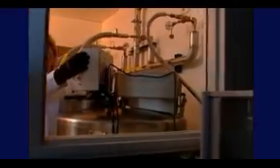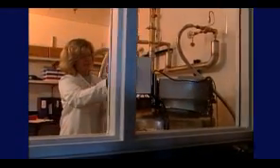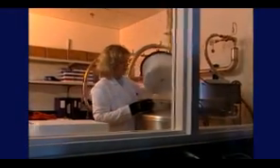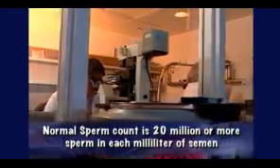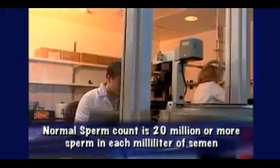The first part of a semen analysis is the sperm count, and the lab staff will do exactly that. They'll count all the sperm in one milliliter of semen. A normal sperm count is 20 million or more sperm in each milliliter of semen.